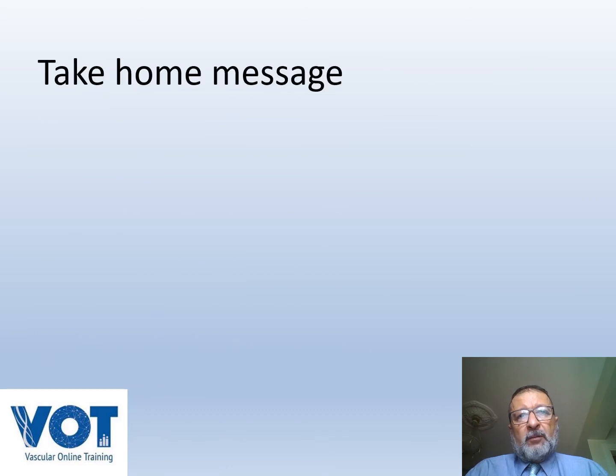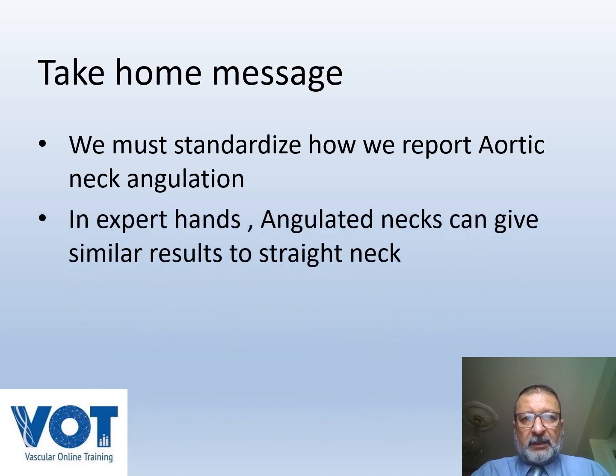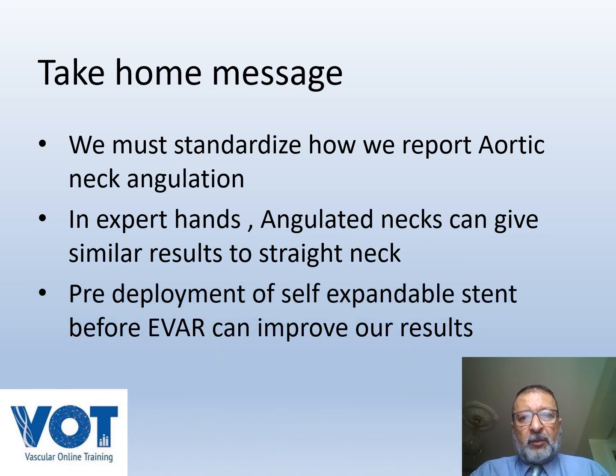So my take-home message from this case is that we must standardize how we report aortic neck, and I think our reporting for aortic neck angulation is inferior to the international standard. In expert hands, an angulated neck can give a similar midterm result to a straight neck, and pre-deployment of a self-expandable stent before EVAR seems to improve our result, although we have very limited cases to report.